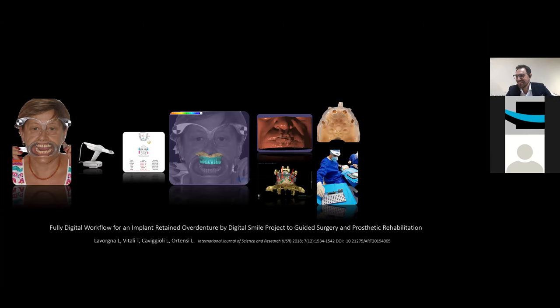Now we have the surgical guide inside the mouth and we can cut the patient in the perfect way. Perfect doesn't mean I am the best surgeon in the world, but it's the best situation because I am a normal dentist and I can put the implants in the right position. This is true. And now this is the best thing that I can do for my patient.